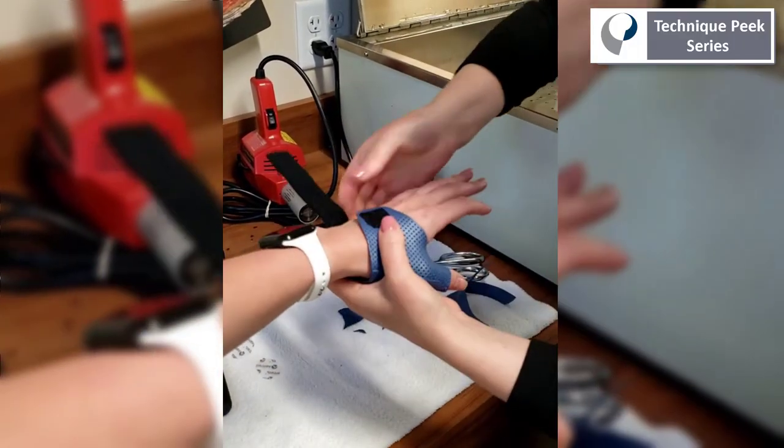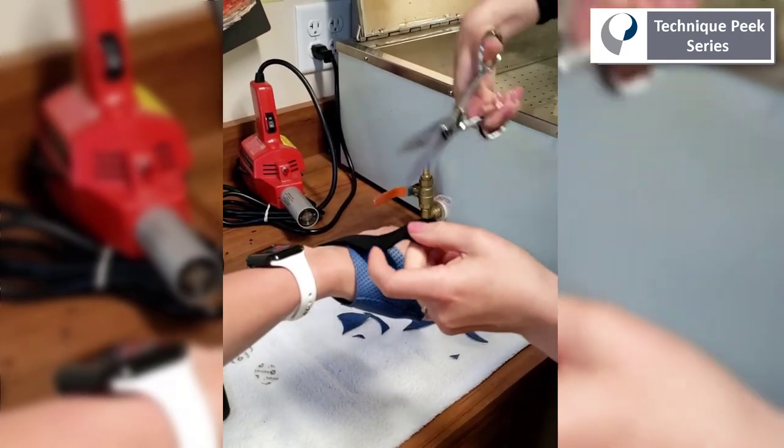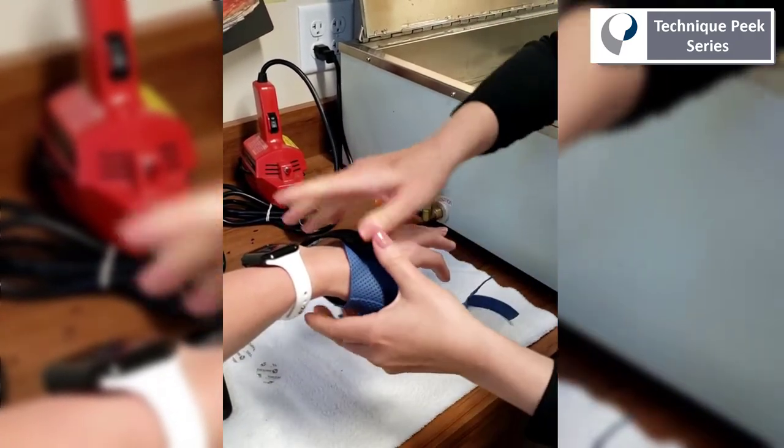And in less than five minutes, we have a thumb spica splint using very little material. Thanks for your time!